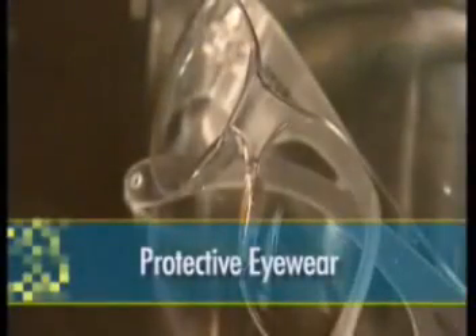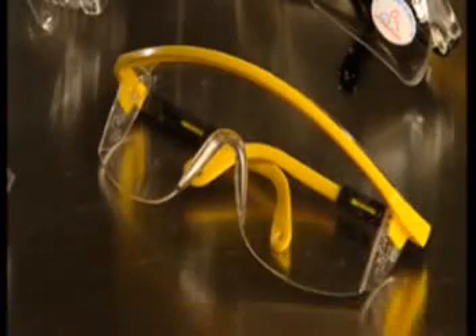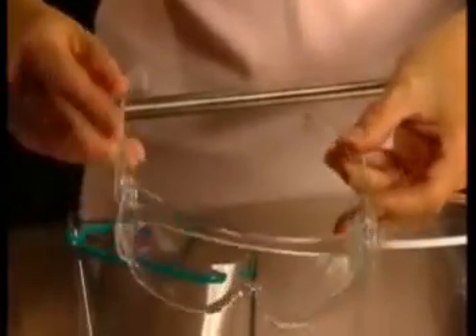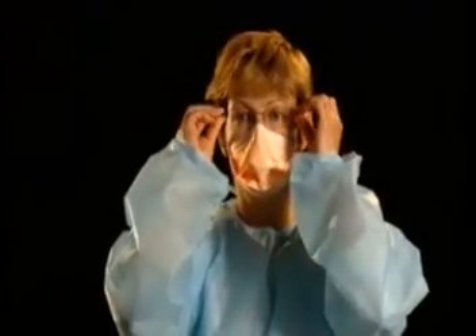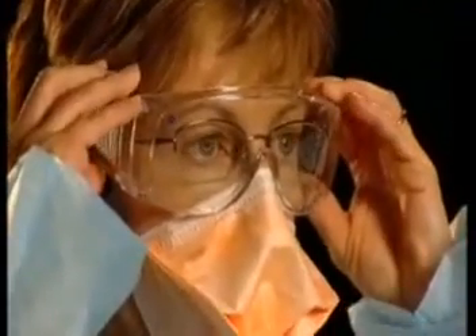Protective eyewear shields your eyes from direct contact with respiratory droplets and accidental contact from contaminated hands. There are a variety of protective eyewear options, which can be referred to as goggles, protective glasses, visors, or face shields. If you wear prescription eyewear, put these on prior to the protective eyewear. When putting on any type of eyewear, it is good practice to use the arms of the frame — this keeps your hands away from your eyes and reinforces safe practice for removal.